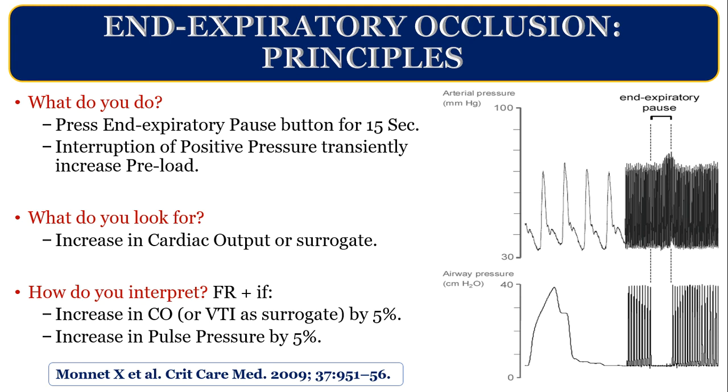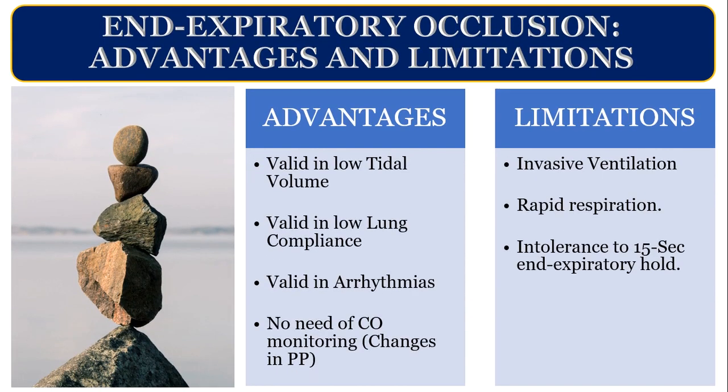ठीक है बेटा? When you do end expiratory occlusion, you expect a rise in the cardiac output. In the end inspiratory occlusion, you expect a decrease in the cardiac output. If both the tests are positive, then you can say this patient is fluid responsive. So this is a good test, but there are advantages and there are limitations.